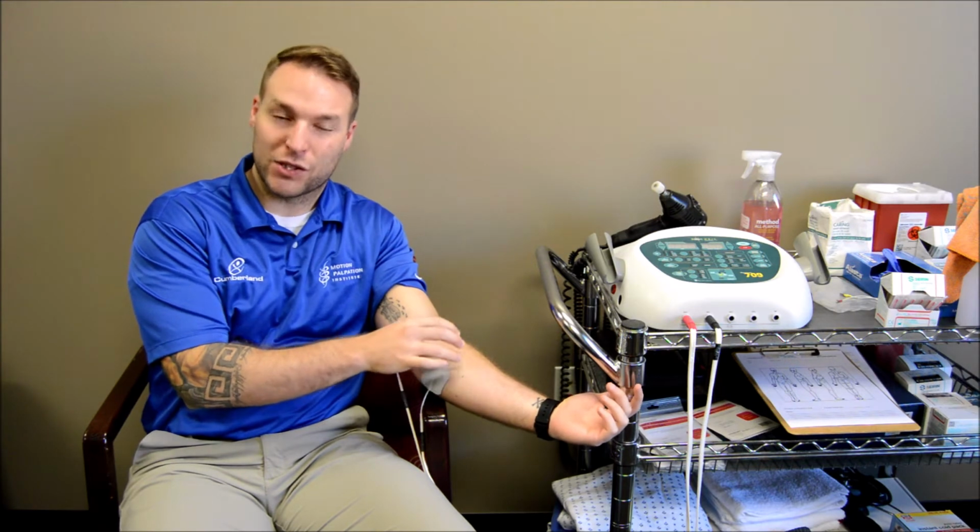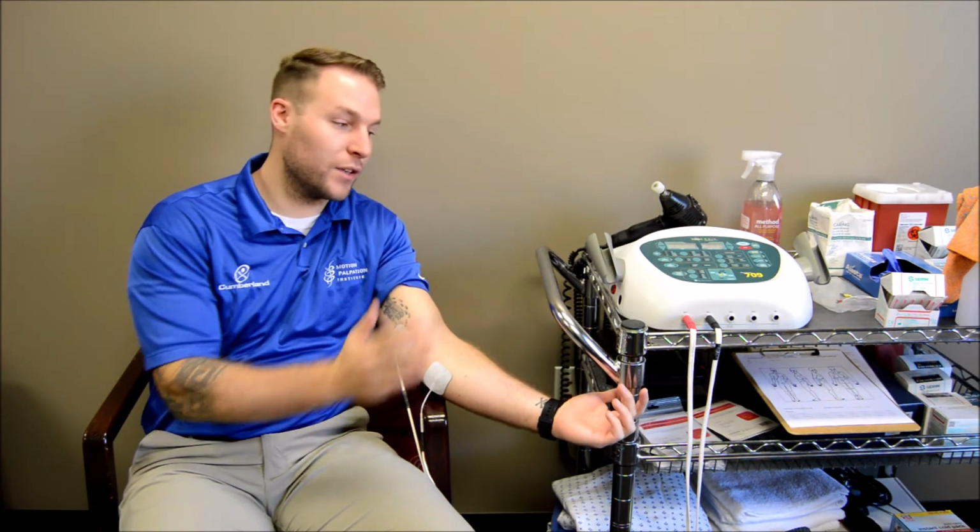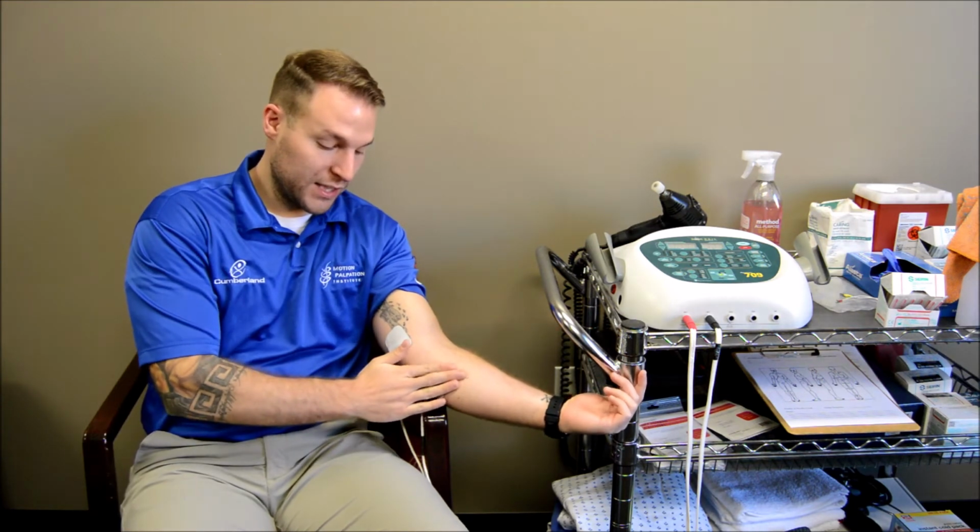All right, one of the other things we like to utilize in our office sometimes for those really tough acute cases, if I can't get my hands on something that's so sensitive to touch that I'm not going to be able to get any work done, we like to use our E-Stim machine. It's kind of like your at-home TENS unit. Most people have experienced something like this before or kind of know what it is. We use these sticky pads to kind of put them around the area.